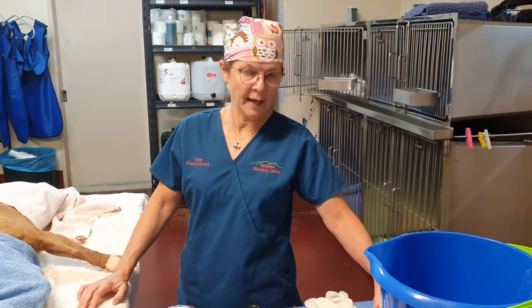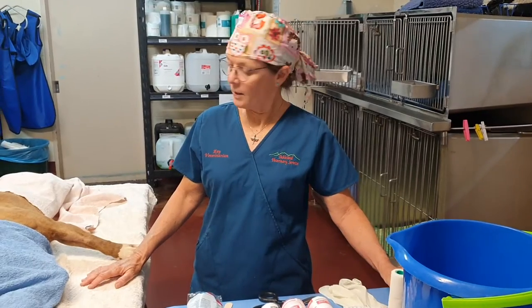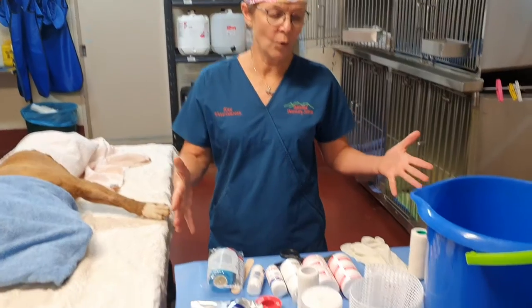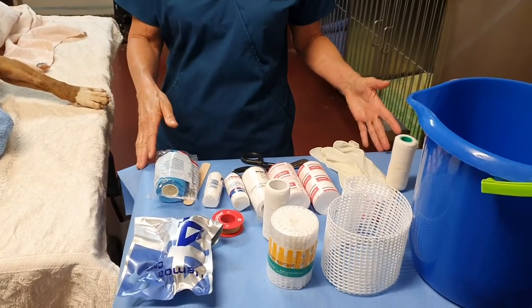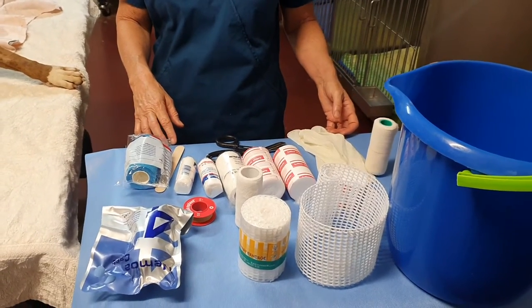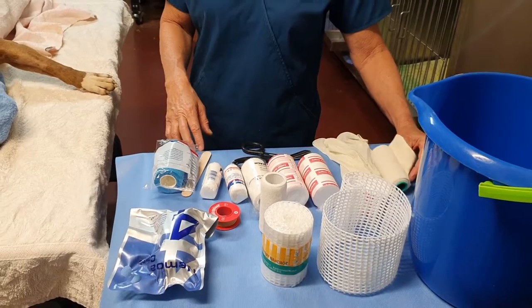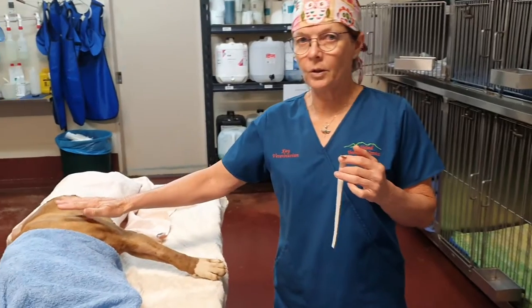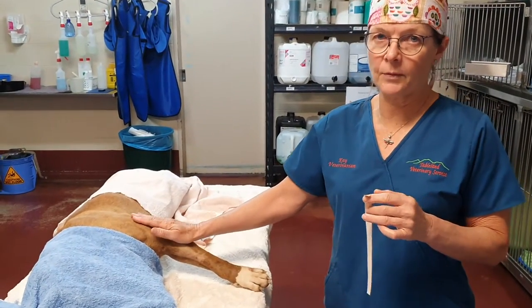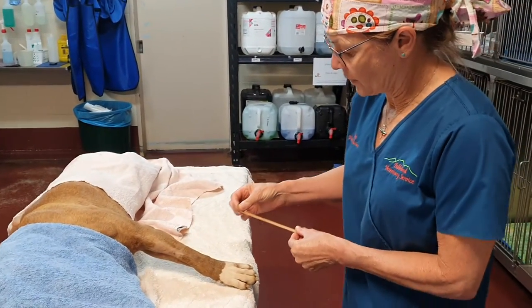This is a demonstration on applying a lateral splint. The base layer can be used as a base layer for applying a cast as well. So have all your gear organised. I've got specific bits and pieces here but a lot of this stuff is interchangeable, so I will make comment of that as we go. The first thing we're going to do is put a lateral splint on our friend here who is a cadaveric specimen. Thanks to him for donating himself for this.